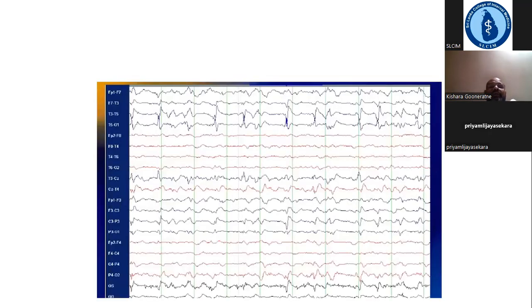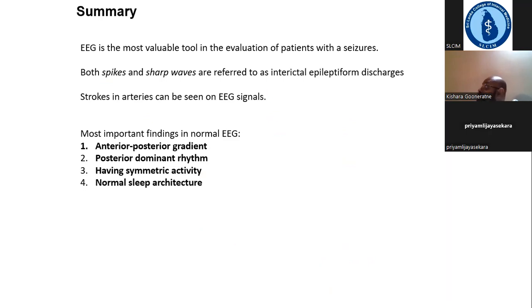You can see on this EEG how it lateralizes, where these epileptiform discharges are confined to the left hemisphere, and it's very periodic, occurring at intervals of between 1 to 2 hertz across the EEG. So this is a morphological example of what PLEDs would look like, right?